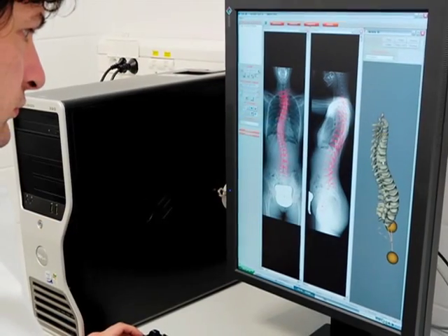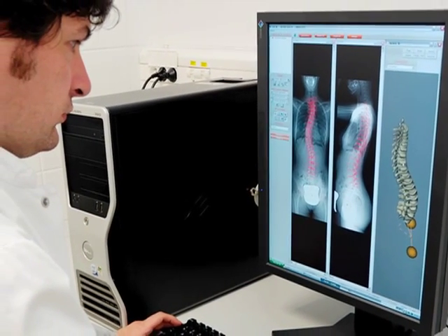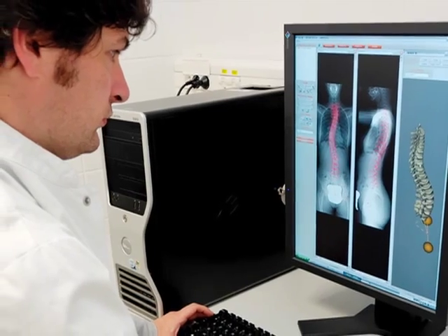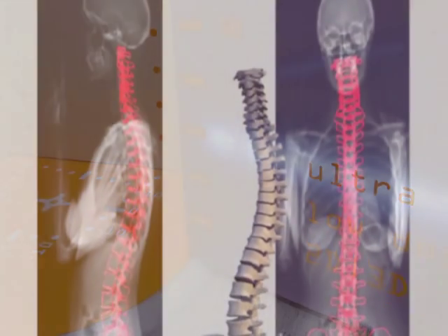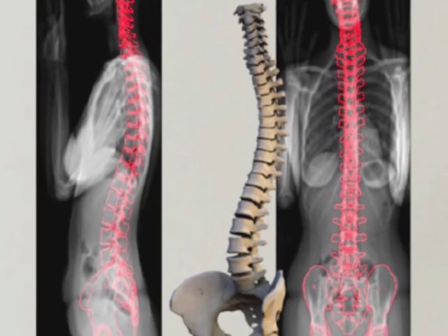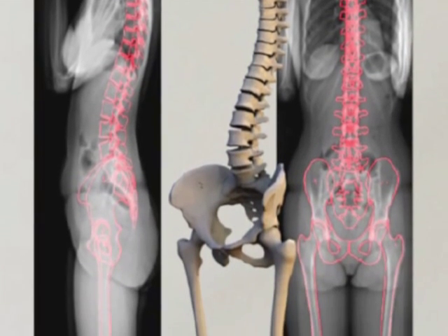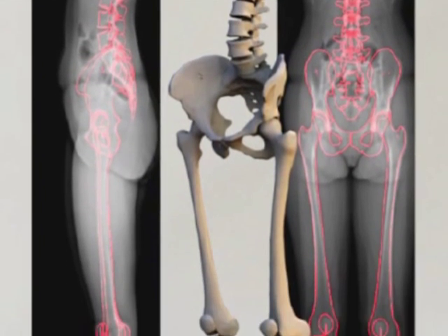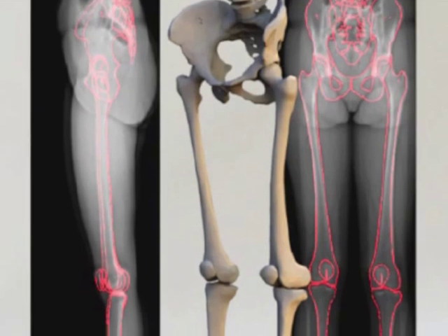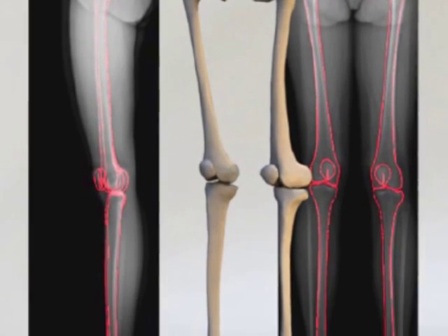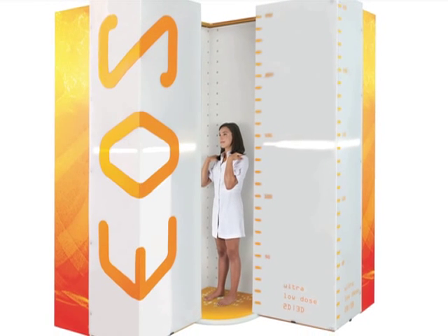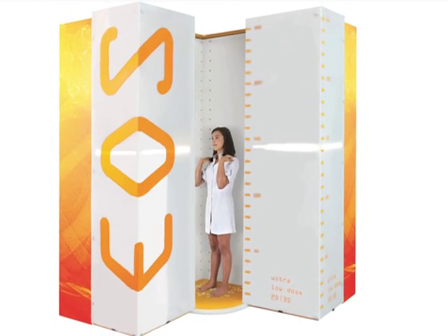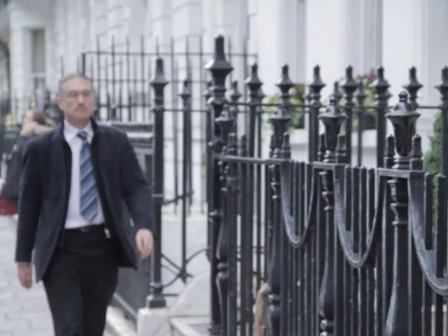EOS enables whole body frontal and lateral images to be acquired simultaneously in a natural standing or seated position, with very low radiation dose and no compromise on image quality. In less than 20 seconds, two full body digital radiographs are taken, and from those two images a 3D bone envelope can then be obtained.